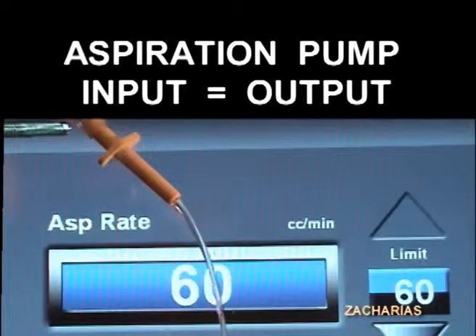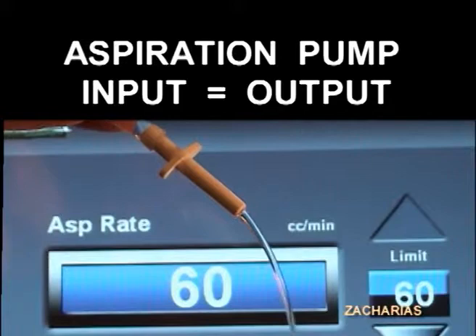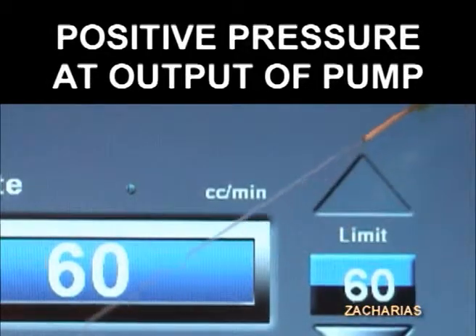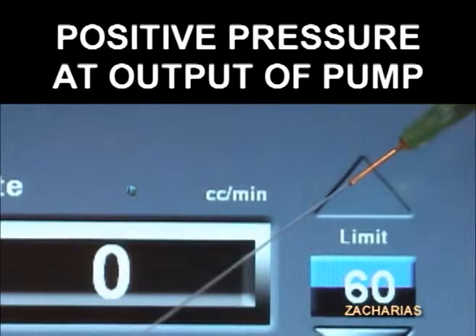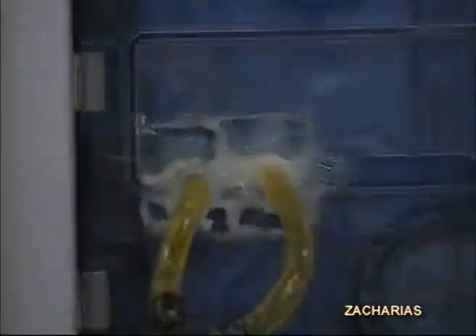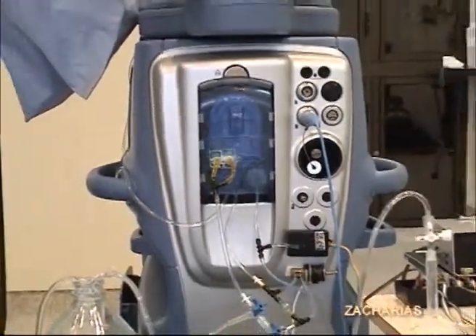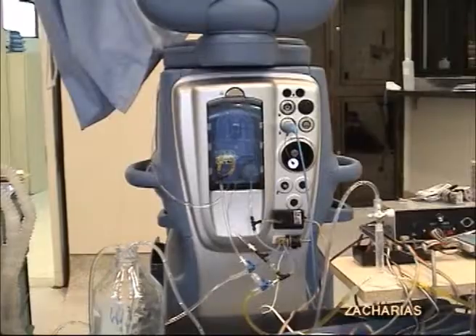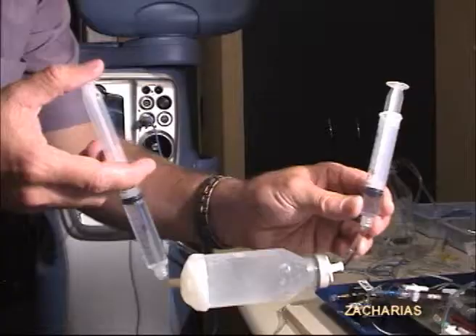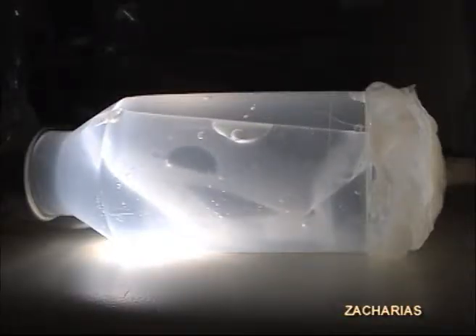The output volume of the aspiration pump of a phaco console is equivalent to the pump input volume being aspirated from the eye. Fluid exiting through the output port of the aspiration pump can develop high positive pressure. Based on these two concepts, a fluidics cartridge was modified to redirect the waste fluid towards the infusion line. An isovolumetric exchange bottle was used to convert the waste fluid volume into clean BSS.